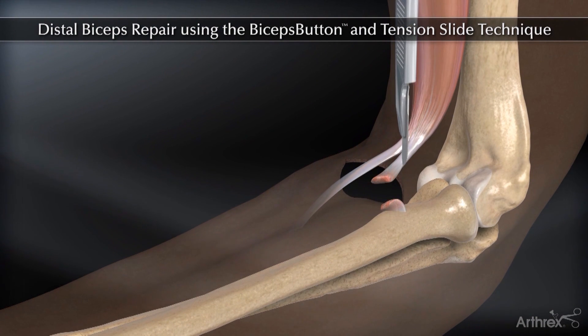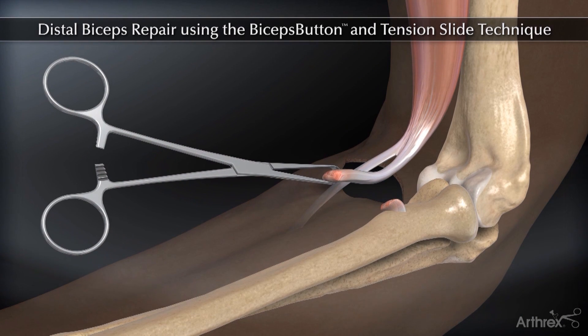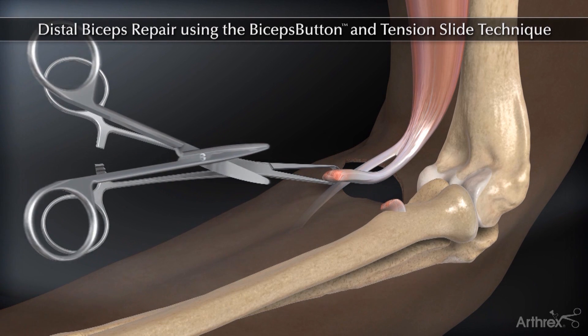Make a single anterior incision in the forearm, identify the distal biceps tendon and debride any compromised tissue.